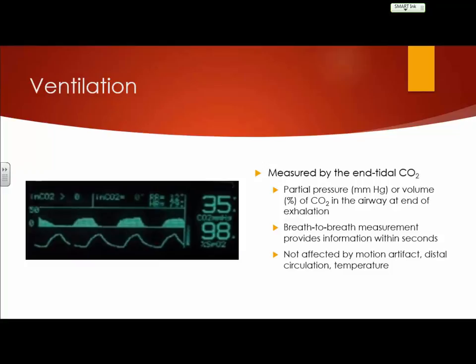So what are we measuring with end-tidal CO2? The partial pressure or the volume in percentage of CO2 in the airway at the end of exhalation. I think I've honed that in. But the good thing about it is that it gives you a breath-to-breath measurement.